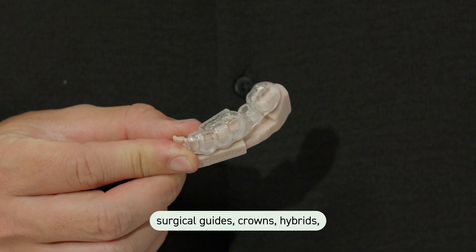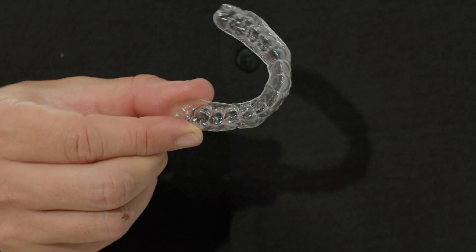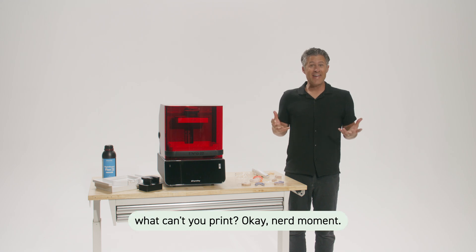Models, night guards, surgical guides, crowns, hybrids, dentures, retainers. The better question is, what can't you print?